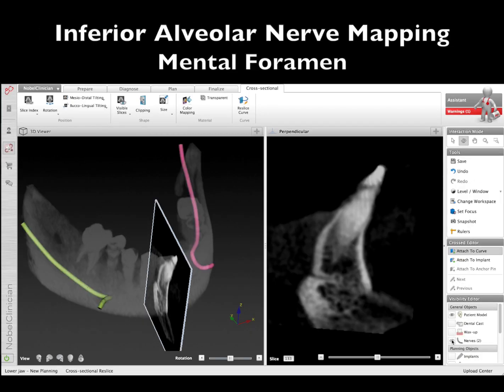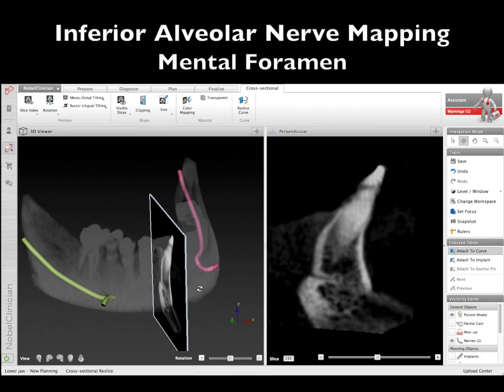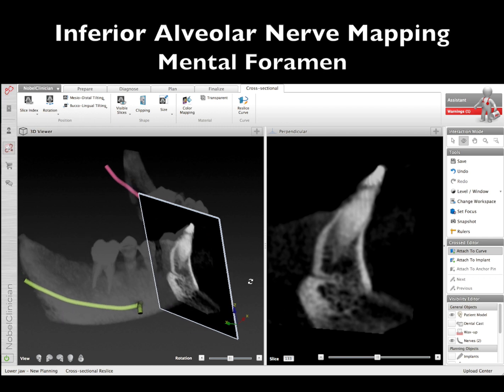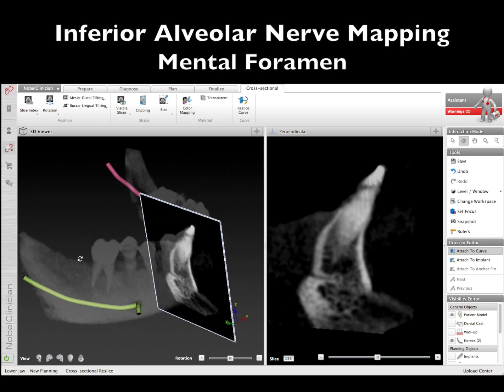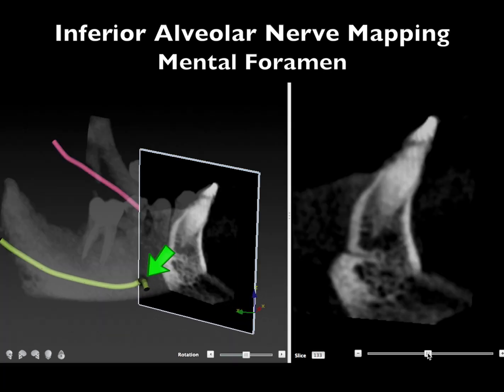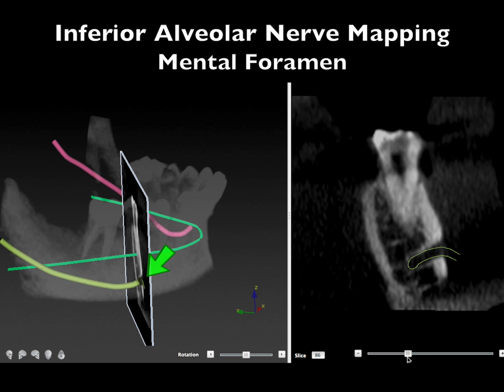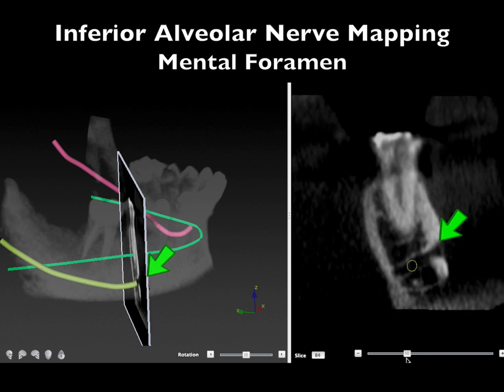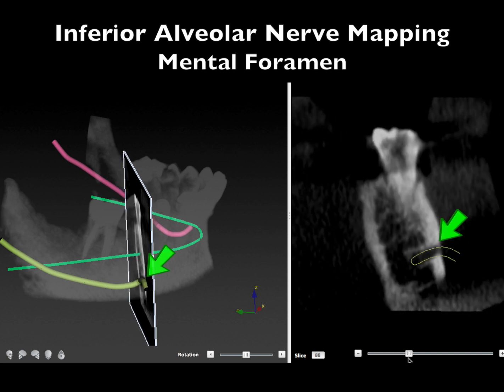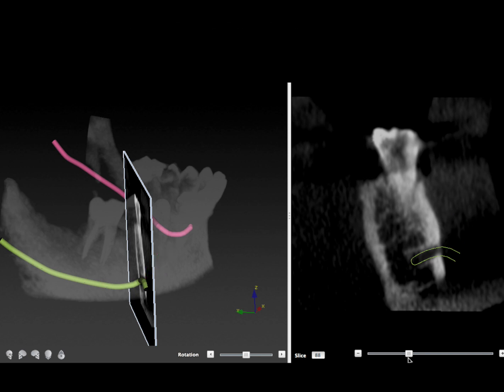The first thing we do is to map out the nerve. We can see the mental foramen very well. We want to isolate this nerve and map it out prior to implant placement so we can see where it is. This is our number one structure that we want to stay away from.